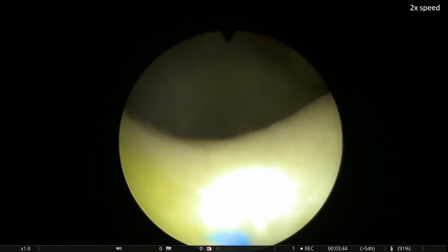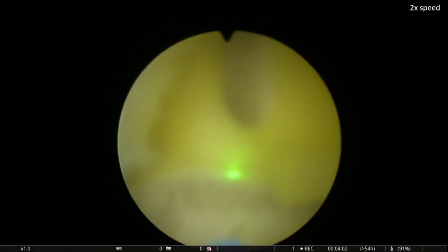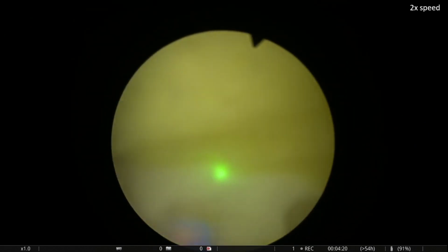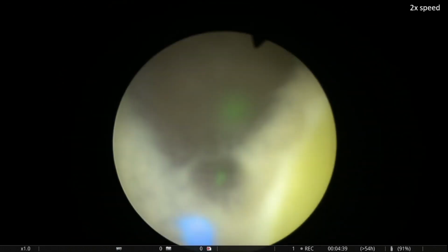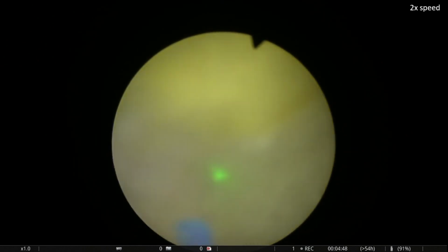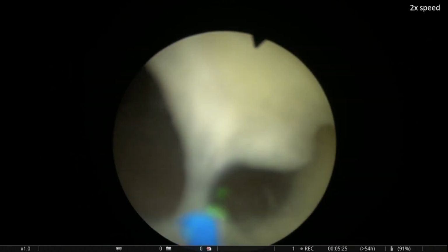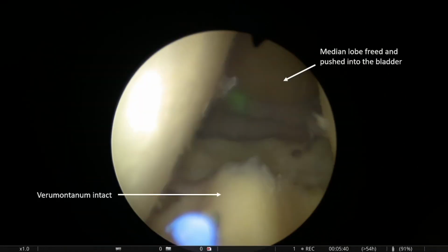Incisions are then made at the 5 and 7 o'clock positions, connecting to the first plane developed. These incisions are deepened, and any remaining attachments are then cut to free the median lobe. The median lobe can be pushed into the bladder to await morcellation while the lateral lobes are enucleated.